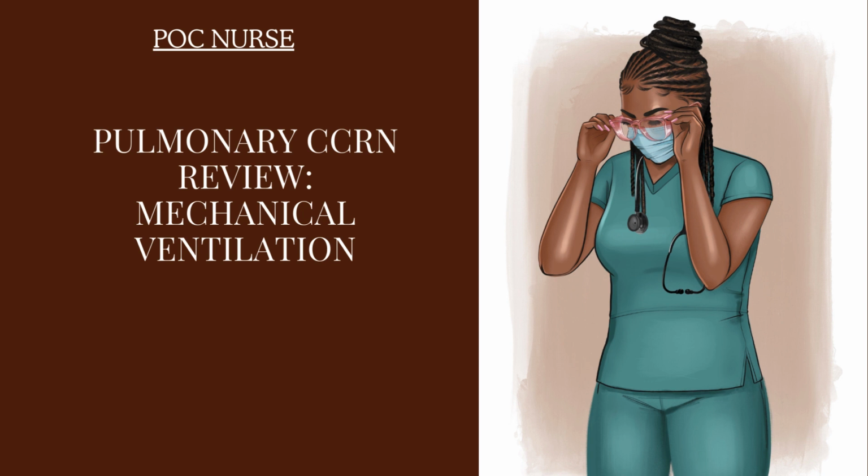For a patient to be mechanically ventilated, they have to be intubated and then connected to the mechanical ventilator. When a patient is intubated, it's important to ensure that the ET tube is in the right place, usually 3 to 5 centimeters above the carina. So to ensure that the ET tube is in the right place, what do we do? 4 things. At the initial phase, we can auscultate both lungs to make sure that there are air sounds when we ventilate the patient through the ET tube.